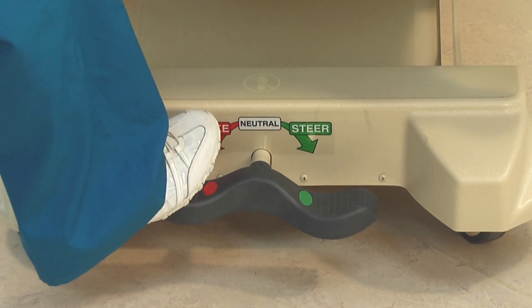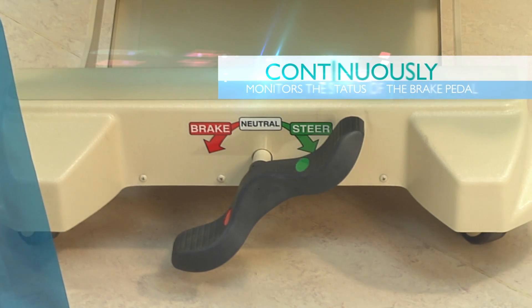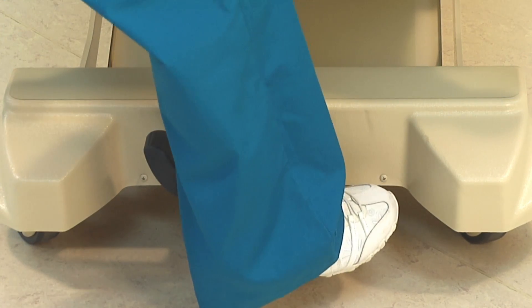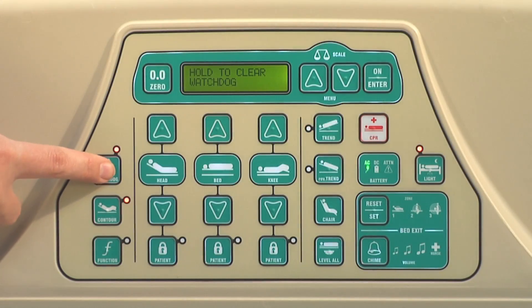Locked bed casters are critical to patient safety, which is why Watchdog continuously monitors the status of the brake pedal. Whenever the brake pedal is not locked, the Watchdog lights will be illuminated solid red.